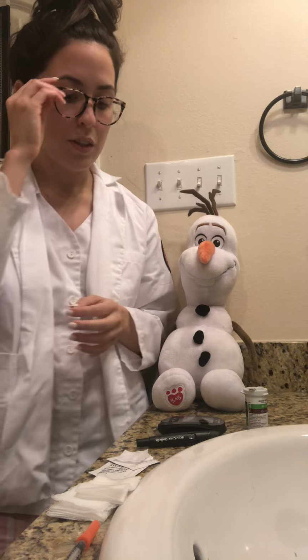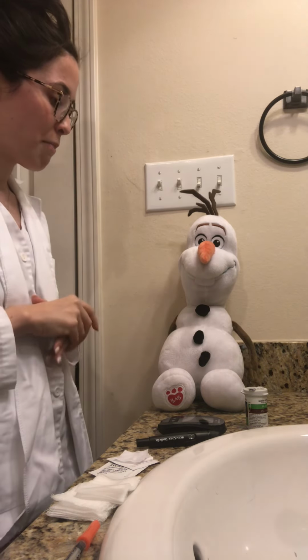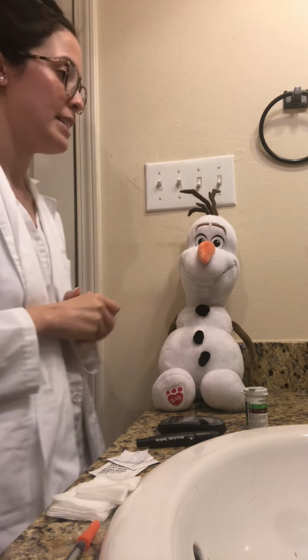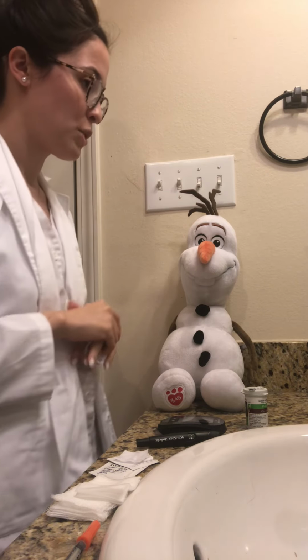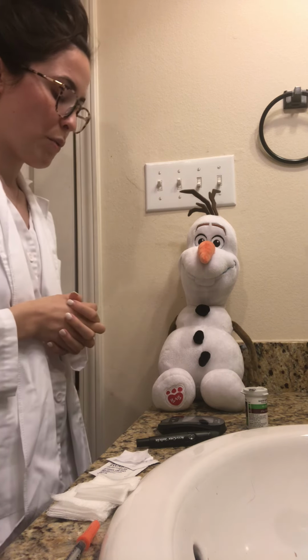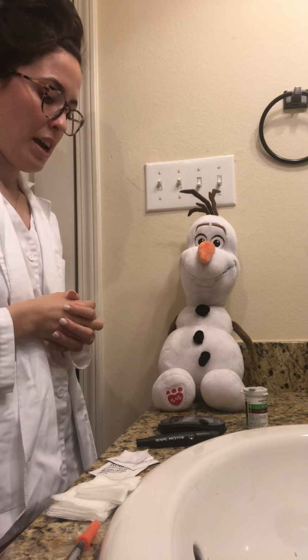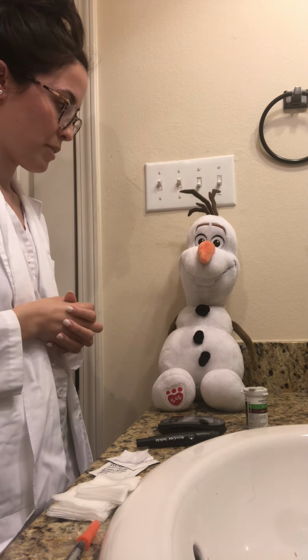Okay? So I'm going to introduce myself to Mr. Olaf real fast. Hi, Mr. Olaf. My name is Alexa. I'm going to be the nurse taking care of you today. Lunch is coming up, so we just want to make sure that we get a blood glucose measurement on you. And once we're done, I will get your insulin if you need any. Do you have any questions about the procedure?